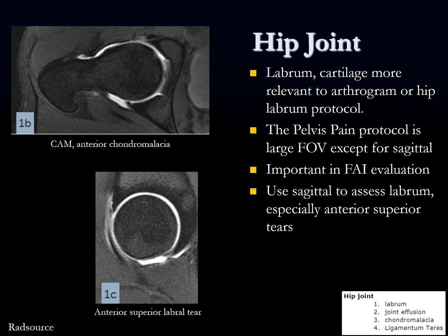Here are examples of cam FAI with labral tear. You can clearly see how the anterior femoral head-neck junction is too protuberant - that's a clear cam morphology. A common place for labral tears with cam FAI is the anterior superior labrum, and here's a nice example of an anterior superior labral tear seen on sagittal imaging.